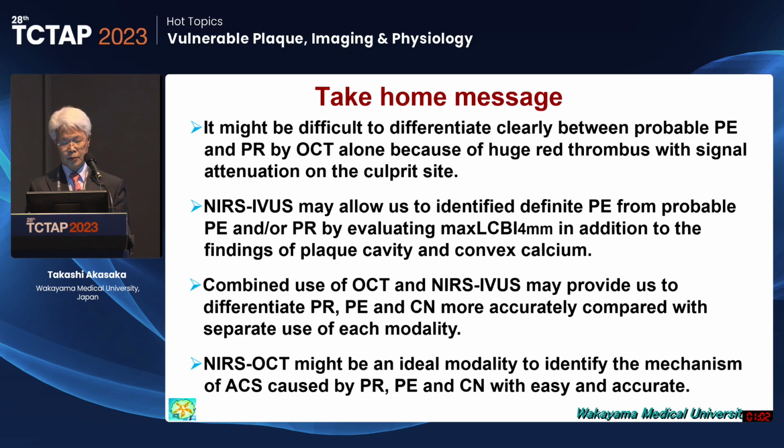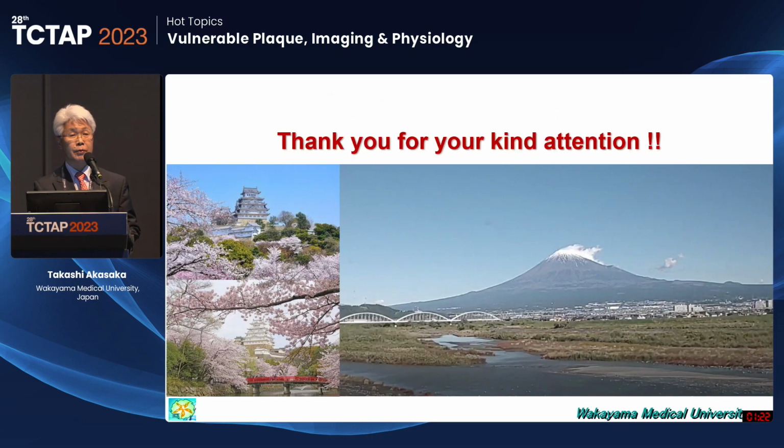And combined use of OCT and NIRS may allow us to differentiate those more accurately compared with separate use of each modality. And NIRS-OCT might be the ideal modality to identify the mechanism of ACS caused by rupture, erosion, and calcified nodule with ease and accuracy. Thank you very much for your kind attention.